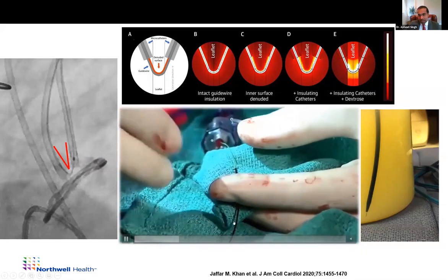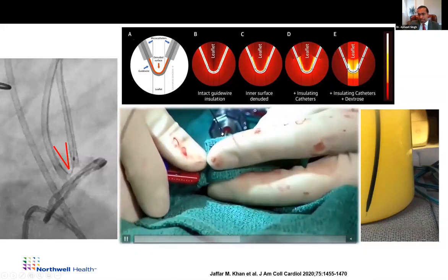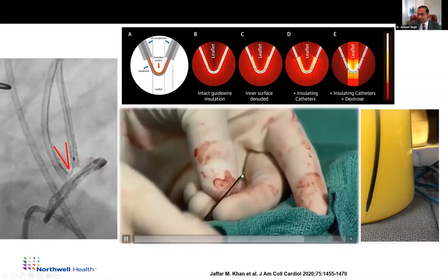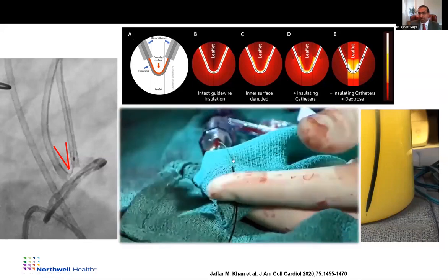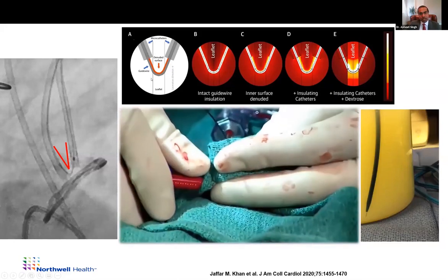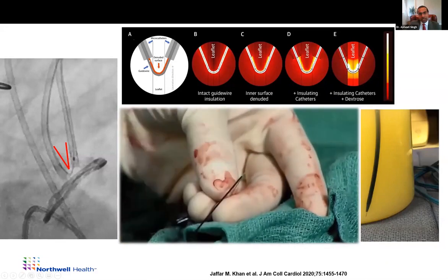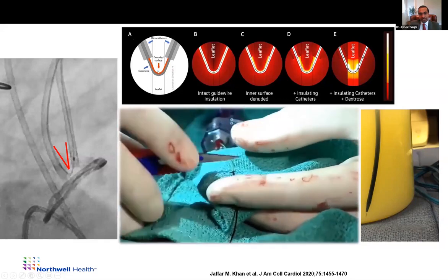There's an insulating microcatheter on the proximal part, and you want to have that loaded on the wire because you don't want any loss of electric current in the catheter when the catheter is in, where the wire may come in contact with the bloodstream or the saline. And if you look at the physics model, this is how it's going to look. You have the flying V, you have the wire that you scraped off the insulation so that you can have electric current focused in that area.